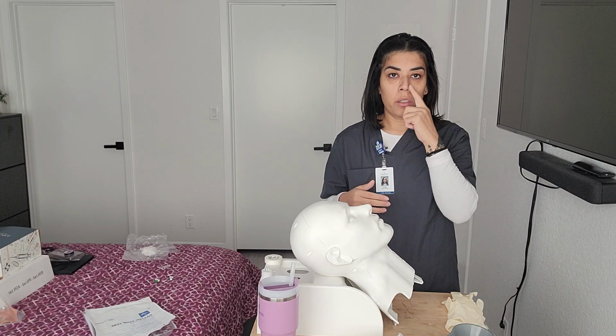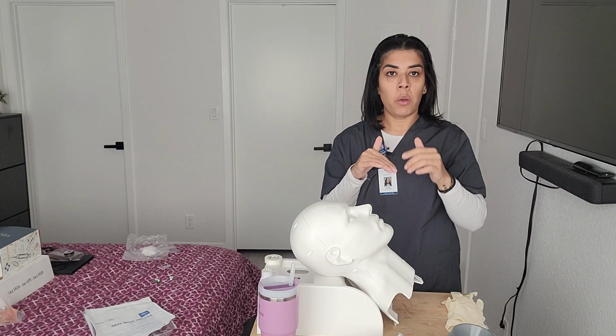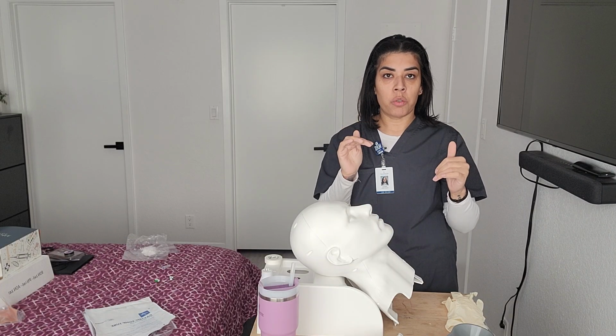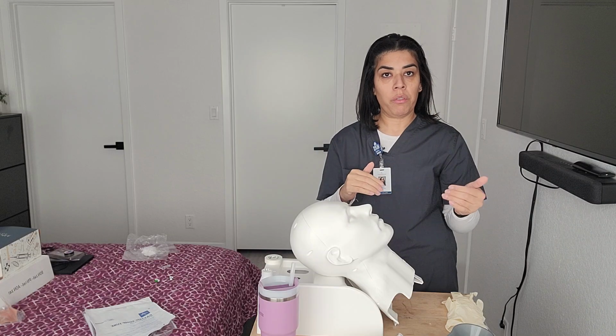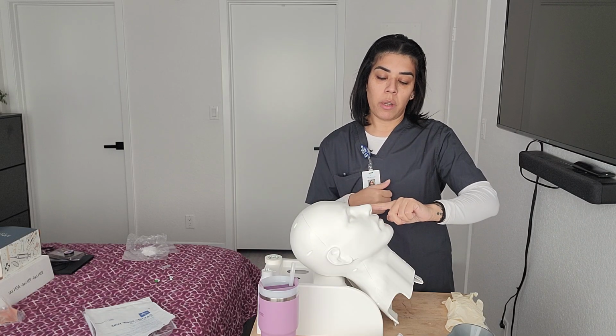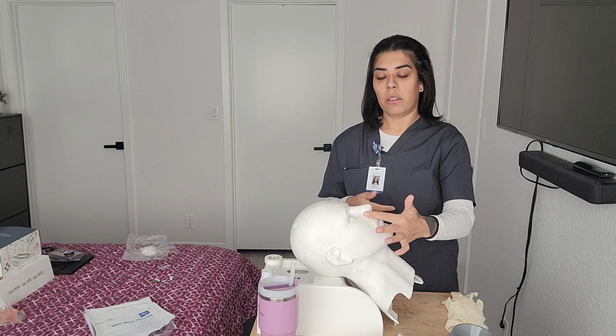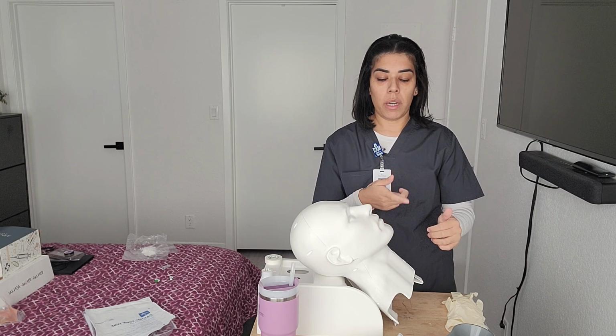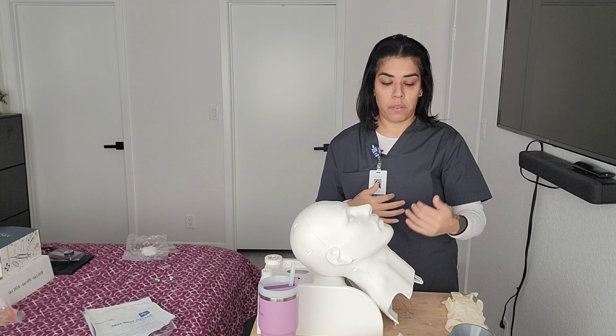We are gonna close one nostril, have the patient blow out. Do the same thing with the opposite side. Have the patient blow out just to make sure which nostril is more patent for the insertion. So go ahead and blow out, sir. Perfect. Go ahead and blow out again. Perfect. Okay, so we're gonna go ahead and do the left nostril just for the video purposes.